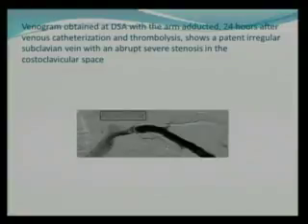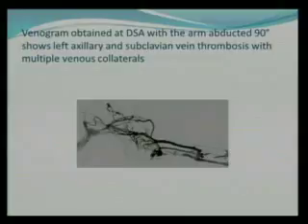So, of course, the patient came here with us. This was the presenting feature. So, what did we do? We did venous thrombolysis. That's very common. That's bread and butter in interventional radiology. You put in your catheters and park them at a particular spot. Here we may have parked them in the proximal subclavian vein.